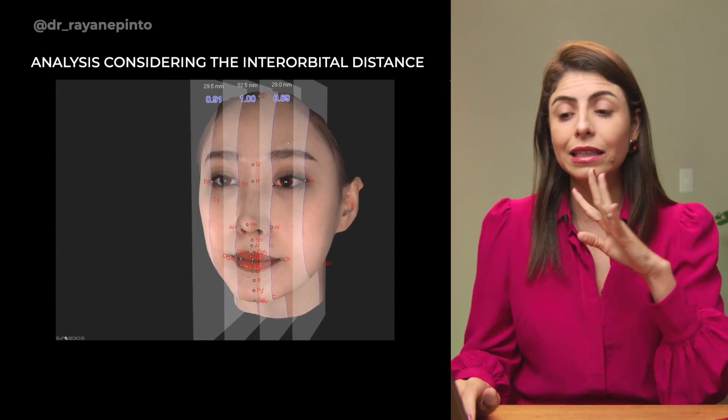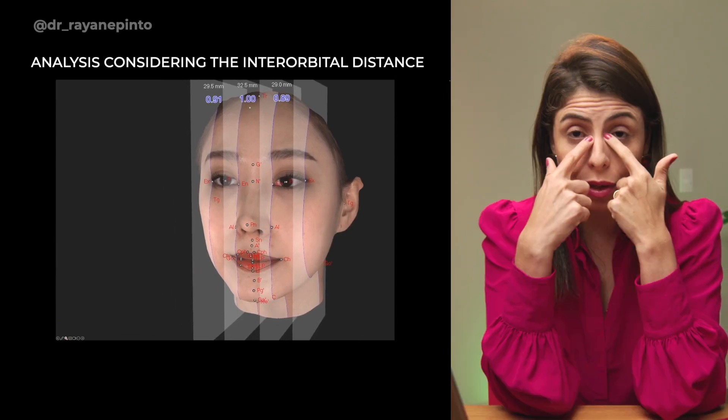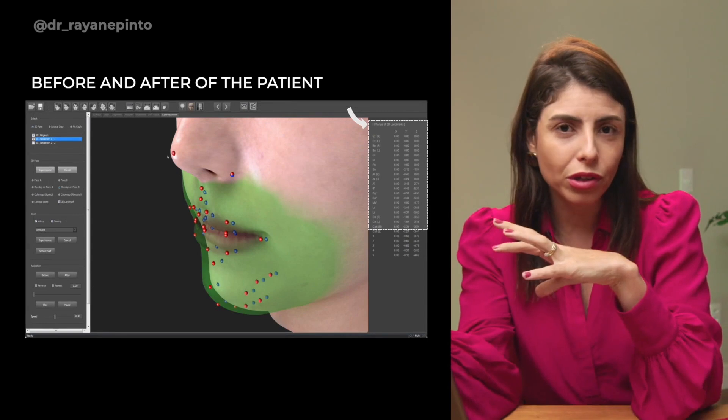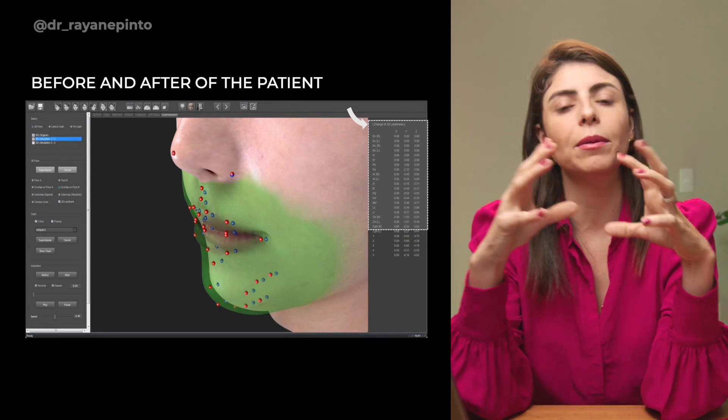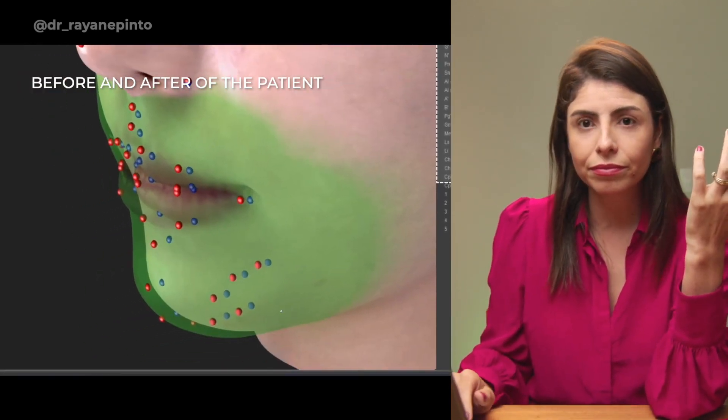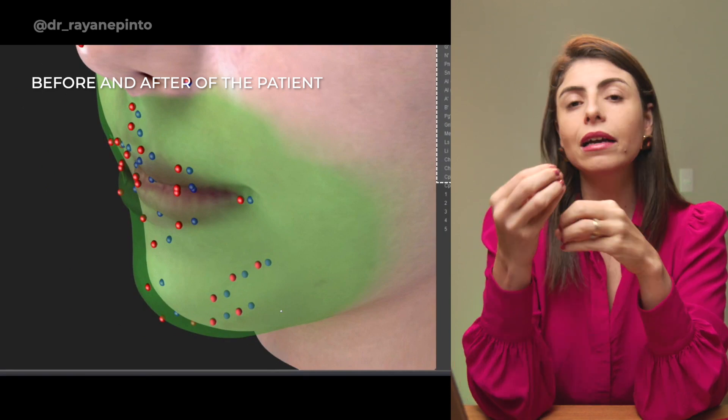There is another tool where you can perform a volume analysis including size considering interorbital distance. There are also other possibilities to create a before and after for the patient, simulating the position of the teeth and mouth and having a 3D analysis of how the change would look after orthodontics. There is also a heat map function — you can take different facial scans over time to track growth and overlay the growth of the patient's face. I'm really excited because now all my children patients will be scanned and I will be able to track the growth of each one.